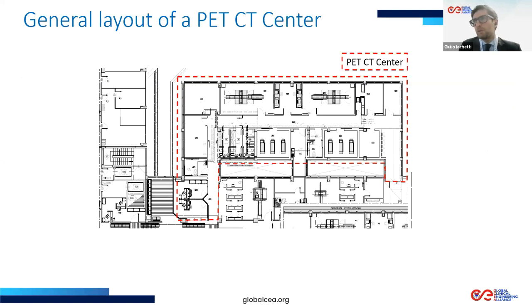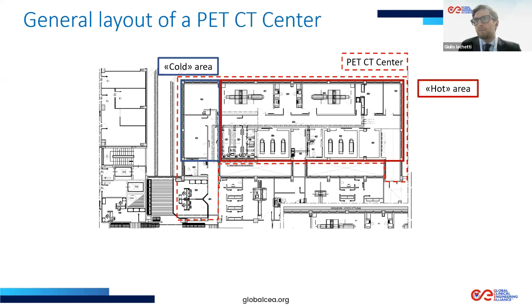I would just show you, first of all, the general workflow of the patient, considering a typical layout of a PET-CT department. This is the PET-CT department of Gemelli Hospital in Rome. In general, you always have to consider different areas. We call them cold area and hot area, not dependent on temperature.